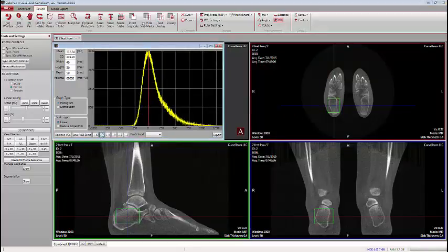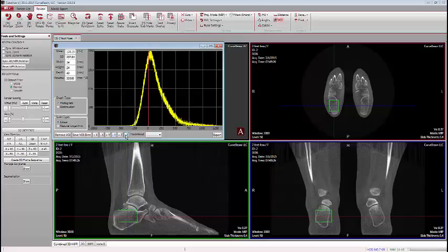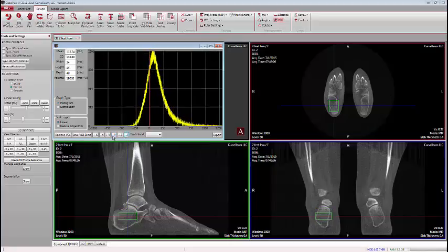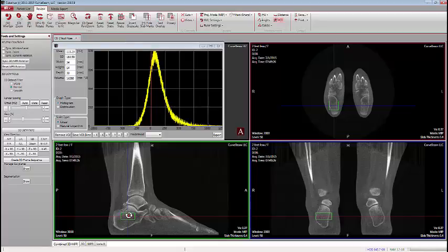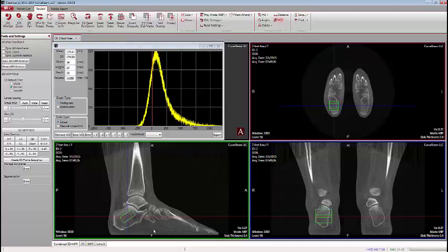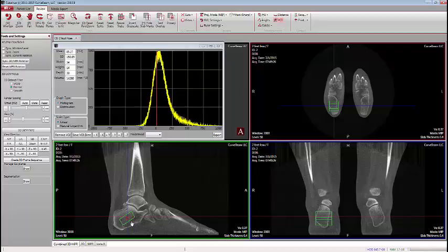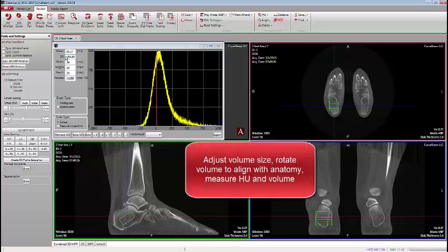We can adjust the dimensions of the cube by clicking on the plus or minus X, Y, and Z controls, shrink it, rotate it to fit the particular shape and orientation of the bone, and reposition it if necessary. This gives us, on a histogram scale, the average standard deviation and mean values of the density of the bone inside the drawn box.